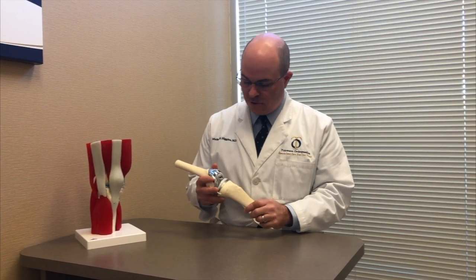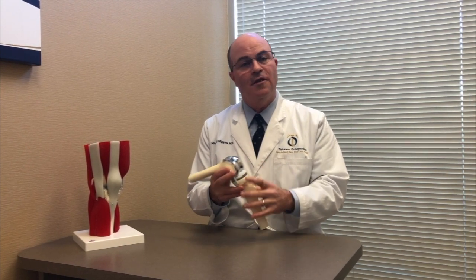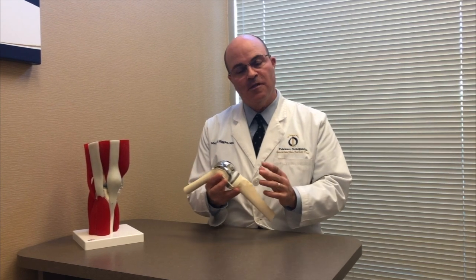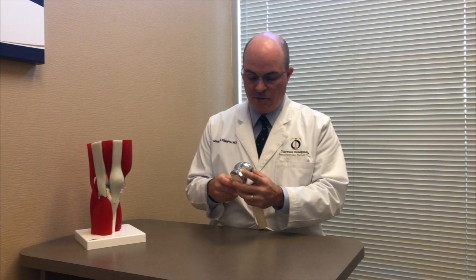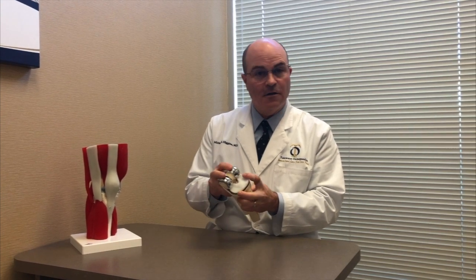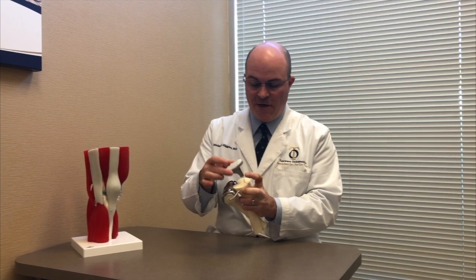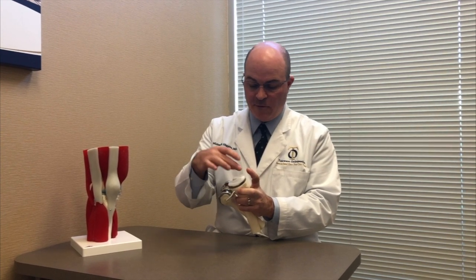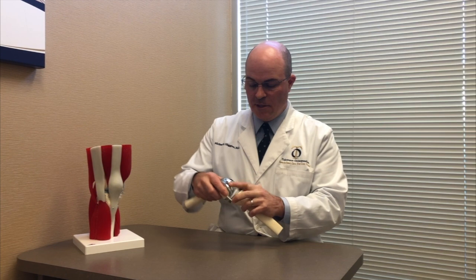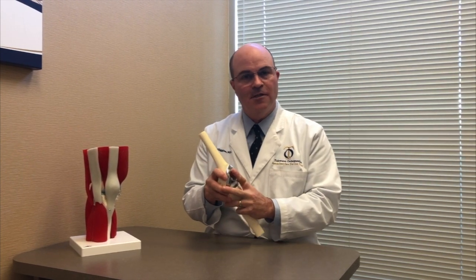If you have an arthritic knee and you're having a knee replacement, what you're going to have with that surgery is an implant put in just like what's shown in this model here. With the knee replacement, the cartilage is replaced. There's a metal cap that goes on the end of the femur to replace the cartilage, and a tray made of titanium that goes on the top of the tibia. A plastic insert goes in that. That's what your prosthesis is made of. That's what the knee replacement is made of.